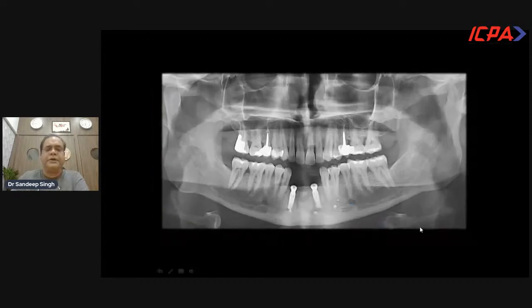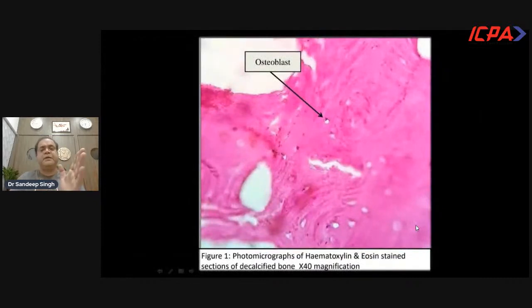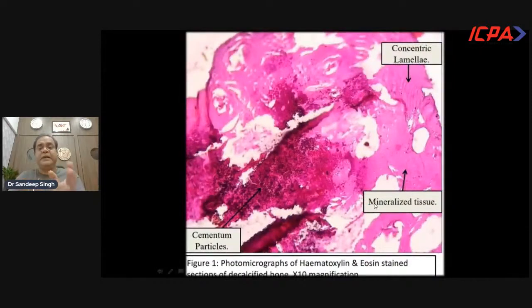And you can see here, wonderful results. An interesting part, you can see when I got my histomorphological sections through my friend who is an oral pathologist here, Dr. Devendra Alrani, who is a great asset to me. A wonderful section with osteoblasts and concentric rings around, but no dentinal graft particle was seen. It was fully resolved, it seems.